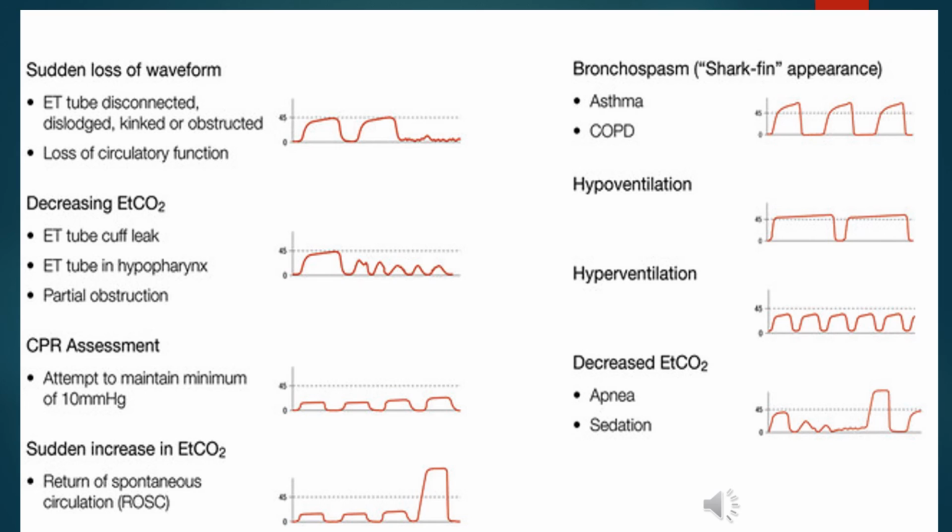You can also look at these waveforms and tell if there's little spontaneous breaths in between the mechanical breaths to tell if your sedation's even deep enough. Same thing could be said if it's conscious sedation and they're supposed to be breathing but in a twilight, so to speak. A sudden loss could mean they're oversedated, and you definitely need to augment their ventilation artificially.